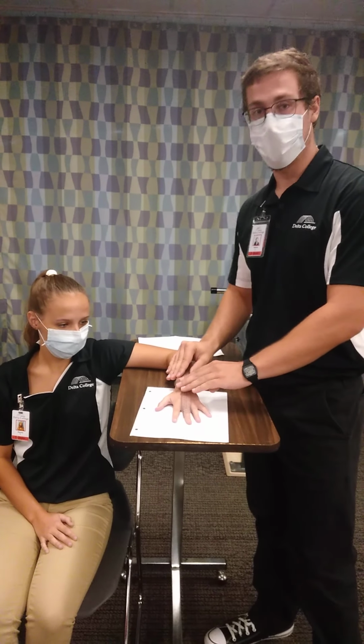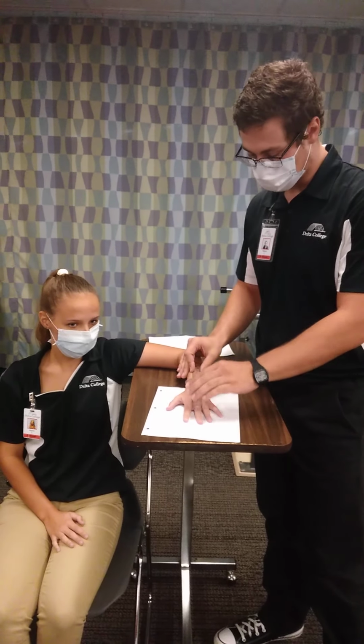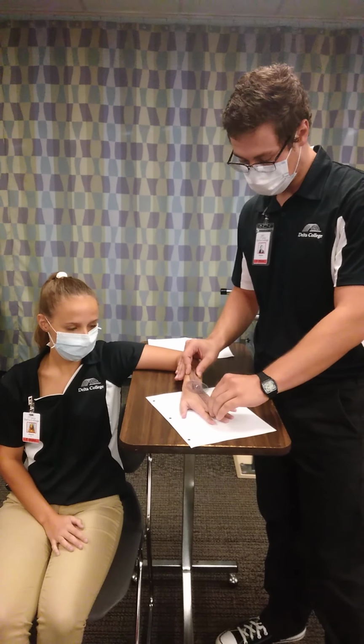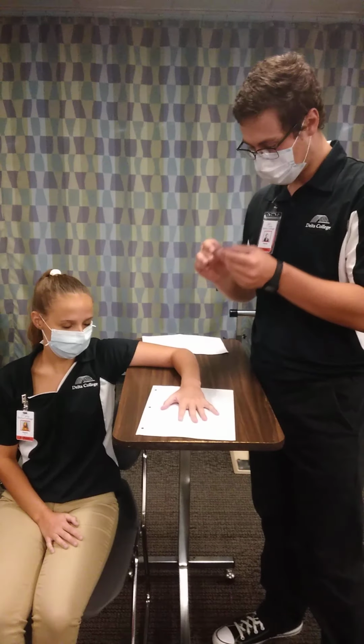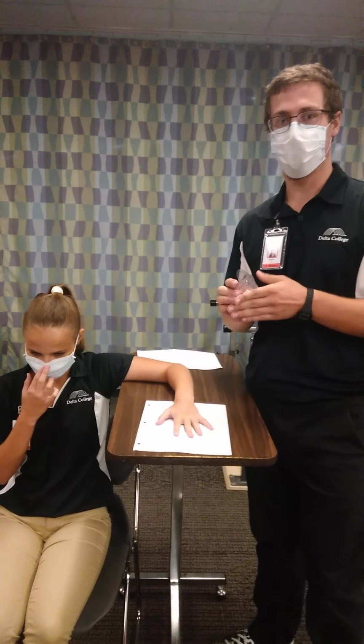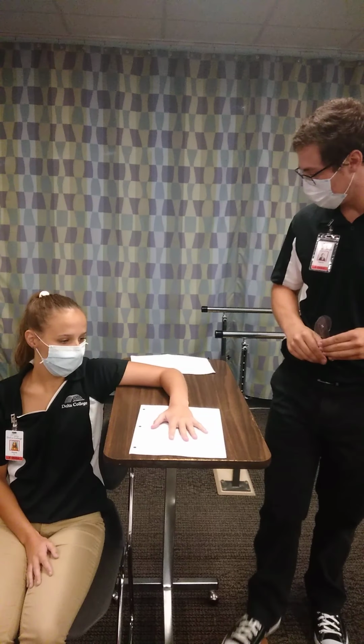And for ulnar deviation, you'll do the same. So when you're ready, it'll be the same starting position, so go ahead, move. And that is just about 19 degrees, which is a little outside the range.